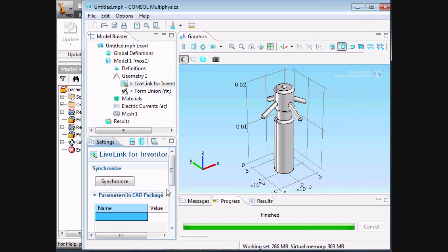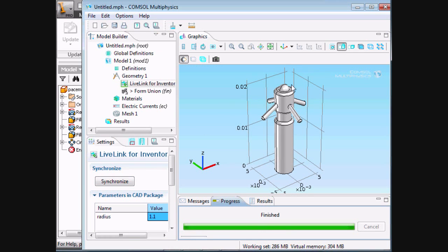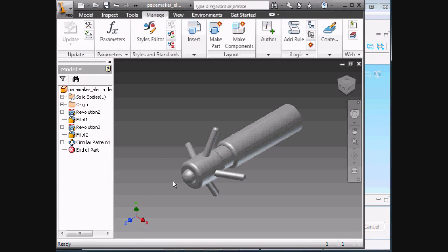Go back to COMSOL, enter radius here, and then change it to 1.1, click synchronize, and here we see that the top electrode node has been changed, both in Inventor and in COMSOL.